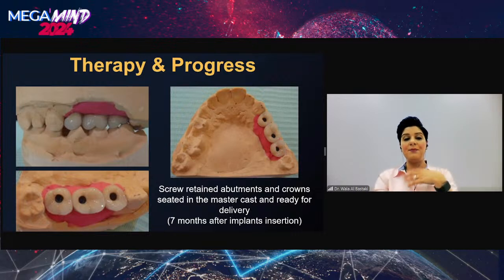And also, I personally prefer to have the crowns individual. Most of the papers say connect them to increase the occlusal table for the forces, but I like to give my patient the chance to floss and clean properly between their crowns.